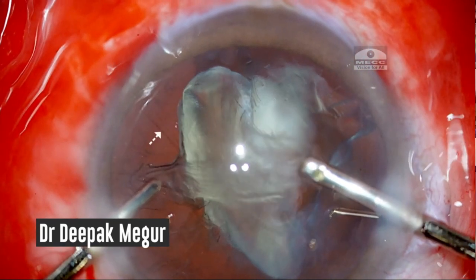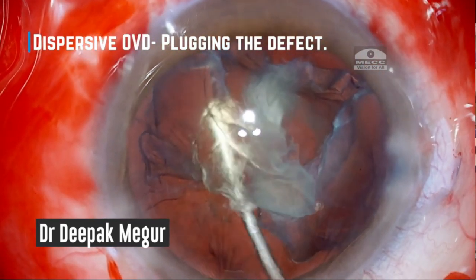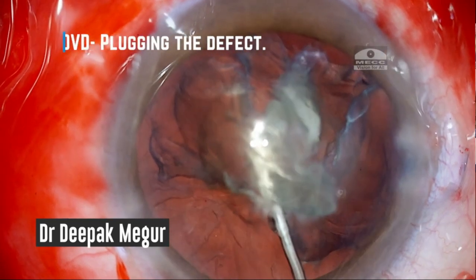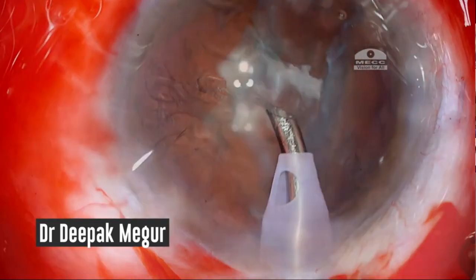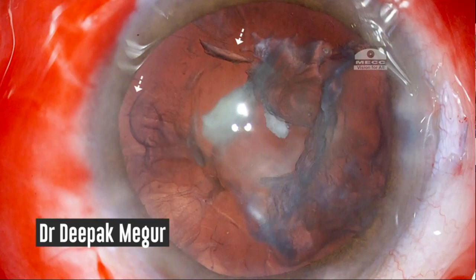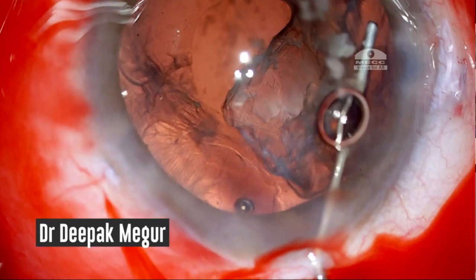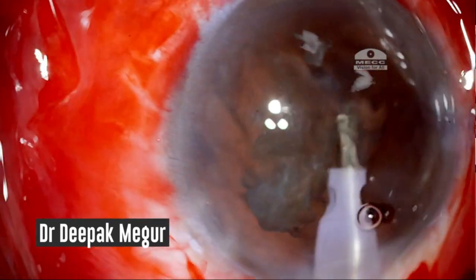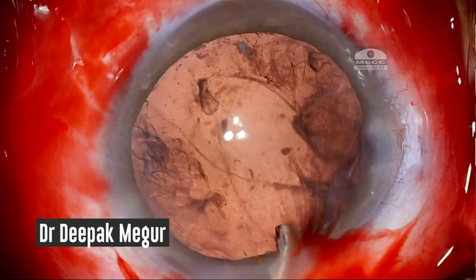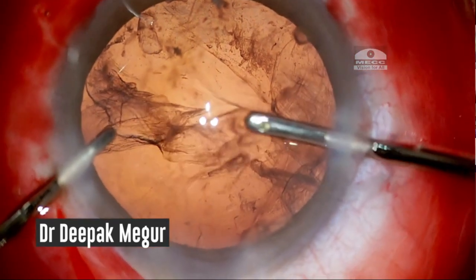As I'm aspirating the cortex, the first time I notice the possibility of a PC tear here. I can see a defect which looks very much like a posterior defect. And again, at this moment, I stop the procedure and go back and inject dispersive OVD just to ensure that the defect is adequately plugged by the dispersive OVD. At the same time, the epinucleus is pushed a little bit more anteriorly. Again, the wide split in the posterior capsule is very much evident. And again, I go back, use my dispersive OVD to plug it. And once it is done, the remaining part of the epinucleus is gently maneuvered into the pupillary zone and again aspirated by my phaco handpiece.